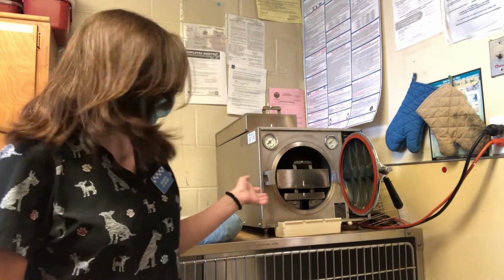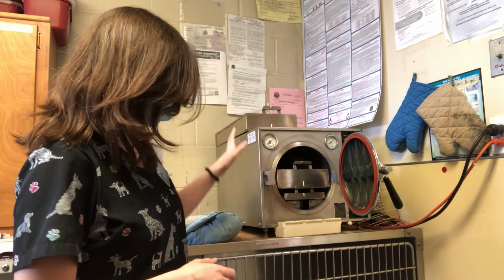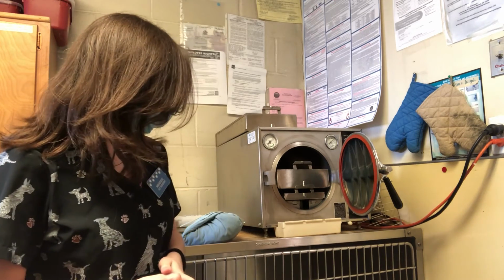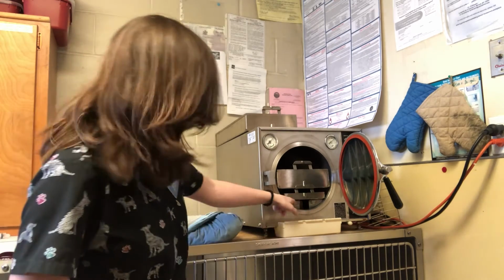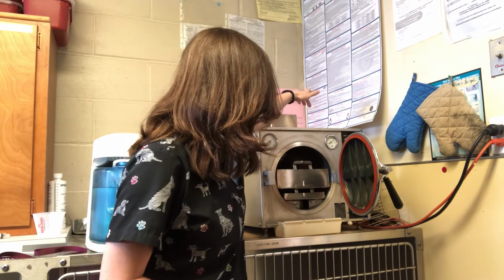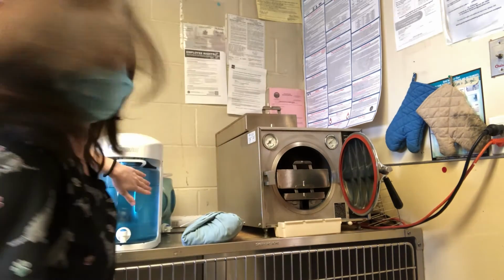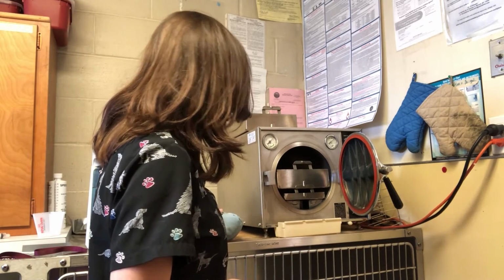So the last part of the cleaning process for instruments and surgical gowns is sterilization, and we would use an autoclave for that. That's a sterilizer. This is a tabletop. So first thing you do is you want to have distilled water filled at the bottom, which I've already done. There's distilled water here, and it goes up through the top. We pour distilled water in, and then we would put our pack in.